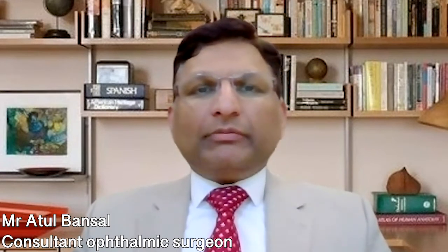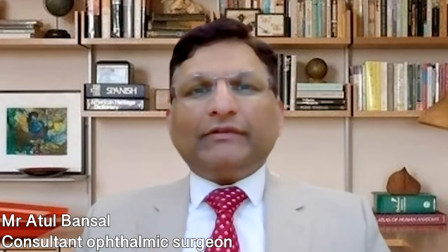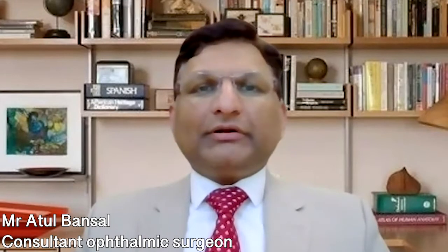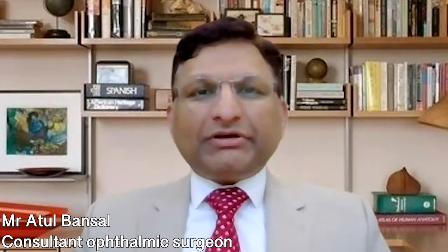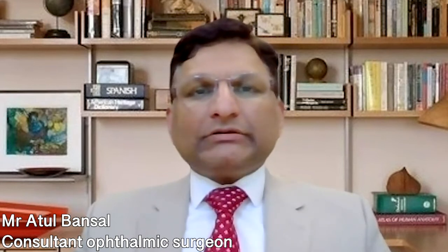YAG laser iridotomy, as it produces a channel between the back part and the front part of the eye, can allow more light to go into the retina, and occasionally, in some patients, can cause a visual phenomenon like white lines or reflections.